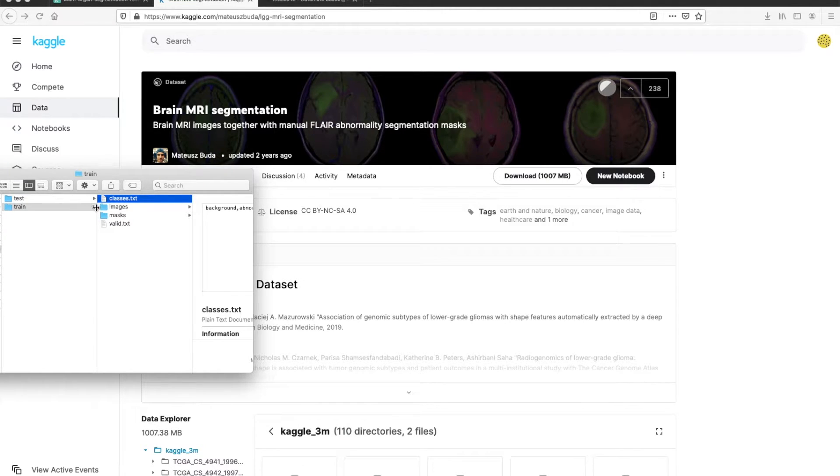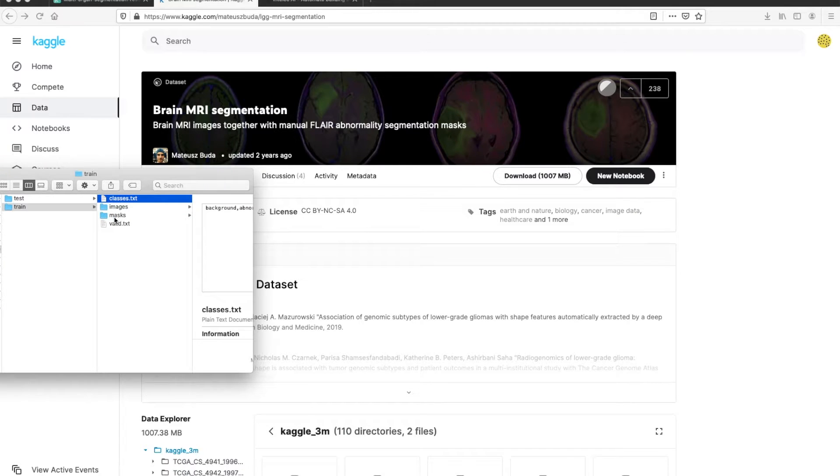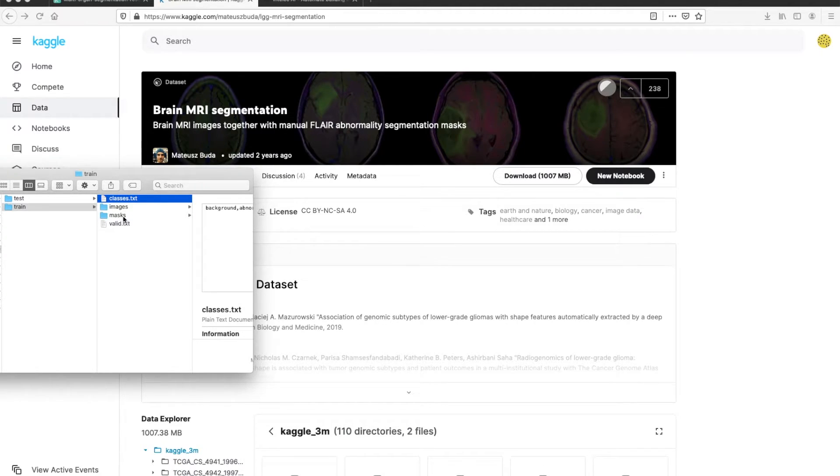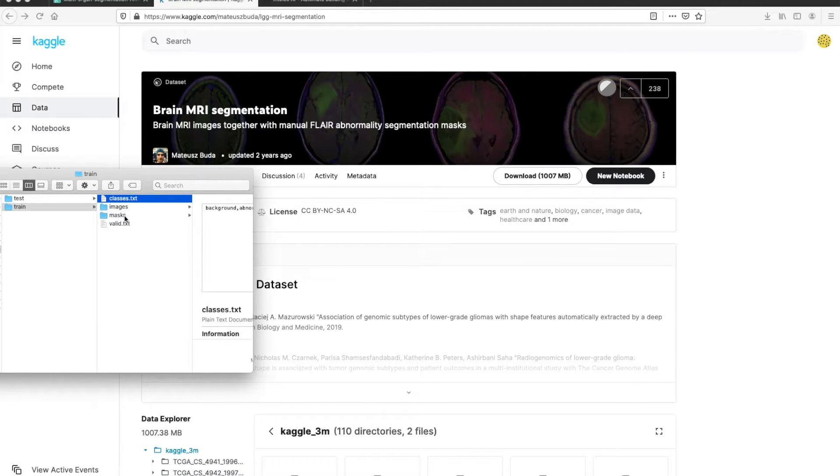Each split has images and masks folders. The images folder contains the actual brain MRI images and the masks folder contains masks which show which part of the image has abnormalities.